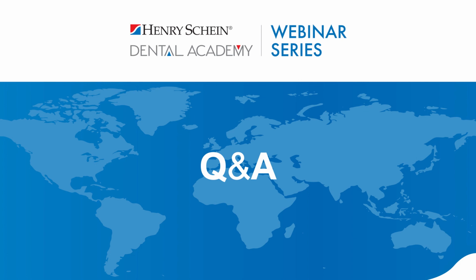Great. We've got a couple comments here about mouthpieces specifically, one of which is Zyris has really good sizing technique training for the Isolite. And then the other one is good mouthpiece sizing is important and you can eliminate waste right from the start. Absolutely.